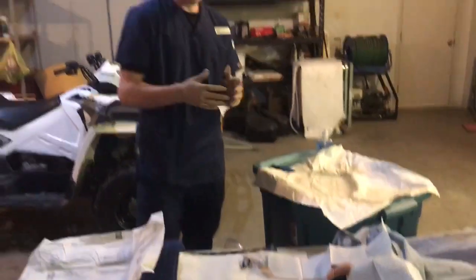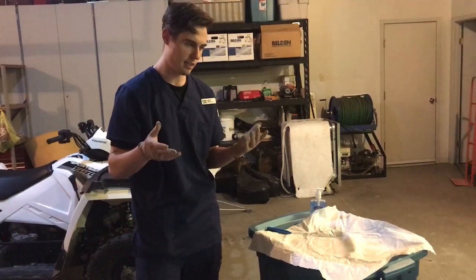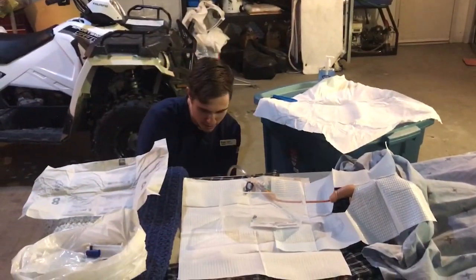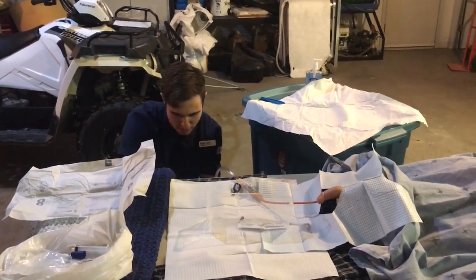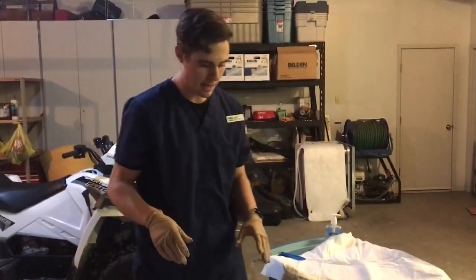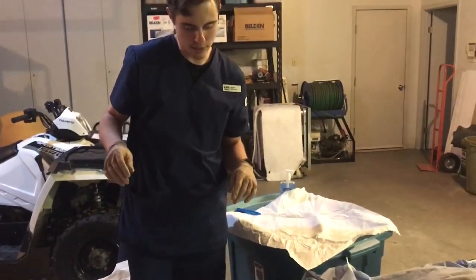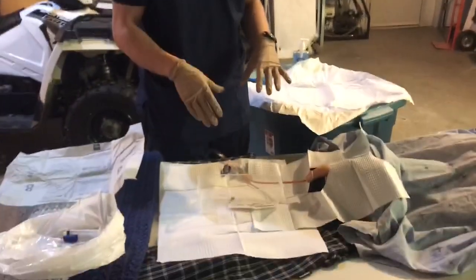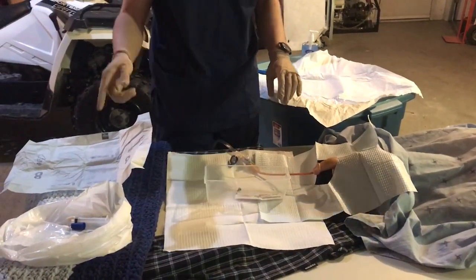And then I'm going to do hand sanitizer, apply clean gloves. So these are now my clean gloves. I'm going to empty and record the drainage bag, the amount that we got, so 250 ml of pale amber aromatic urine. That was the last output there. We'll record that and empty that. So once I'm done that, I'm going to then remove the tape or the stat lock that's holding the catheter to the patient's leg. So I'll remove that, throw it in the garbage.